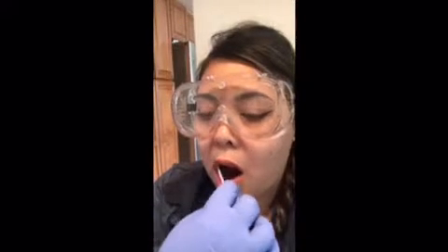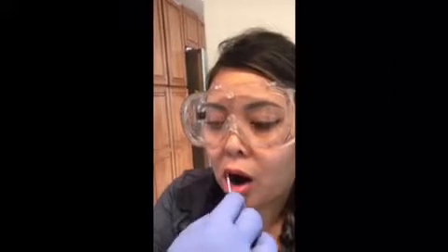Okay, so we're doing the cheek and dental swab. Here we go. Just wiping off any excess.